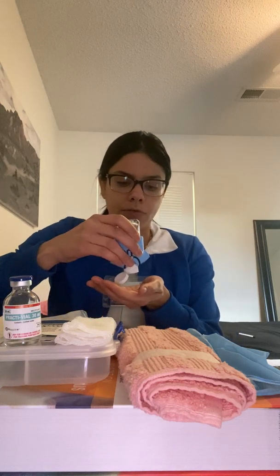First thing I'm going to do is go to my patient's room. I'm going to knock and introduce myself. My name is Saida Gonzalez, and I am going to be your student nurse today, and I'm here to administer an intramuscular injection per the physician's order. And I am going to wash my hands.